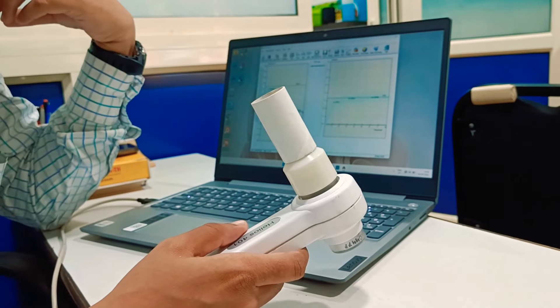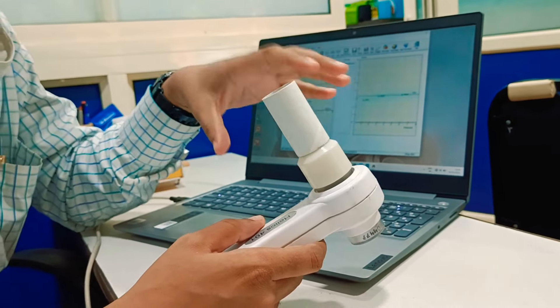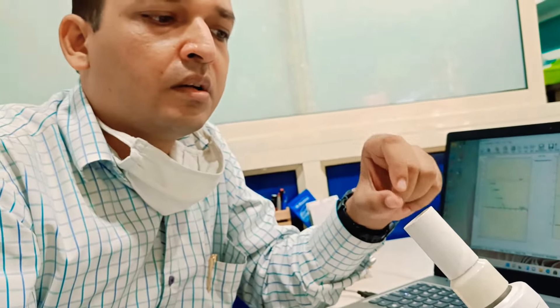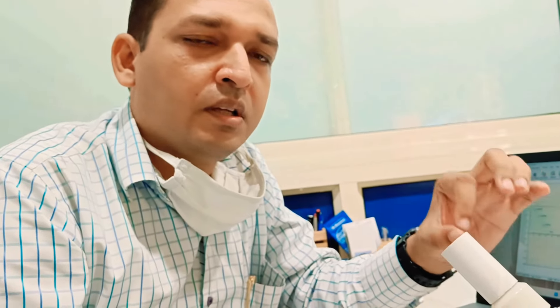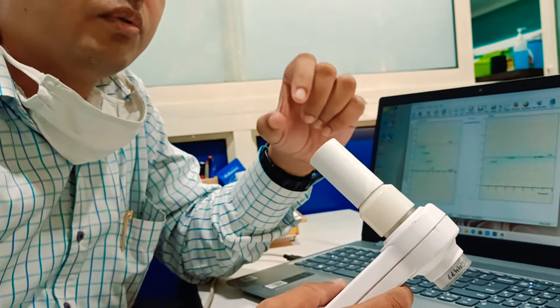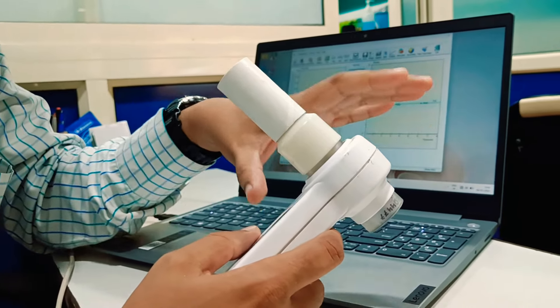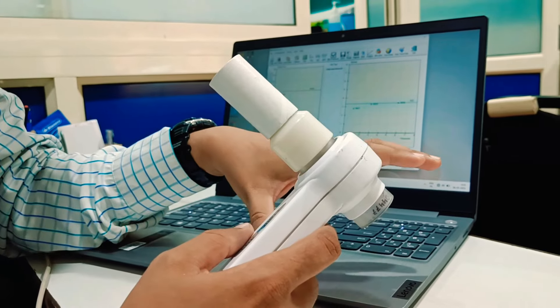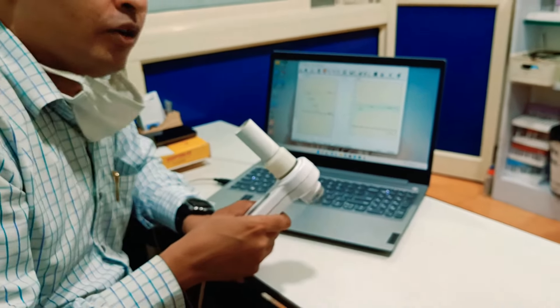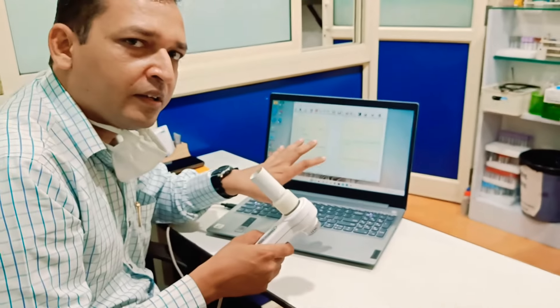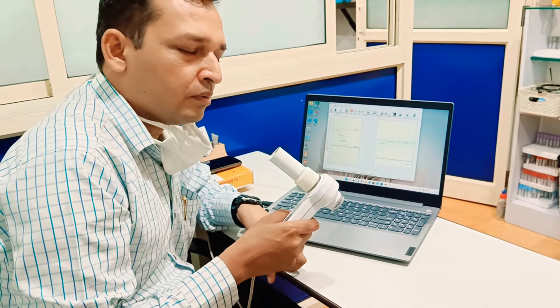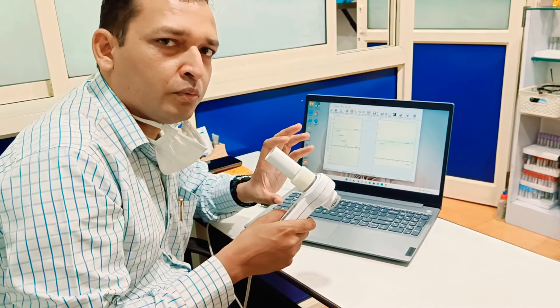Take a deep breath and then exhale forcefully through the machine. While doing so, make sure no air escapes outside the mouthpiece — all air must go through the machine. After at least three seconds of forceful exhalation, you then breathe back in. All the patient data is entered into the software, which is now ready to perform the test.